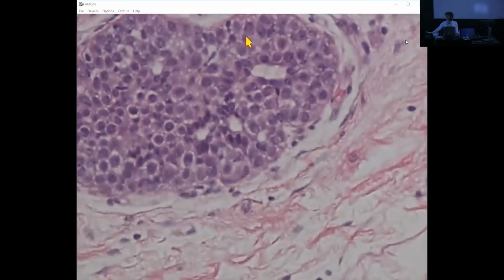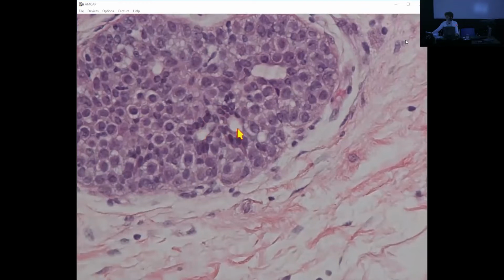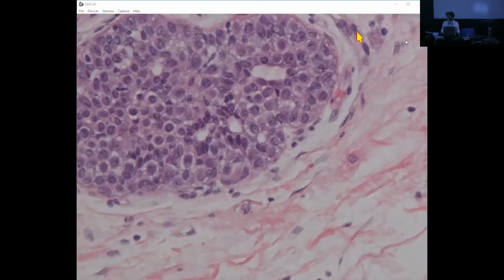Yeah, these ones have a more ductal look, more hyperchromatic nuclei. Here, there may be even collagenous spherulosis. I don't know what this is, and maybe this is also collagenous spherulosis. There are myoepithelial cells up here. There is no question. This is classic lobular neoplasia.